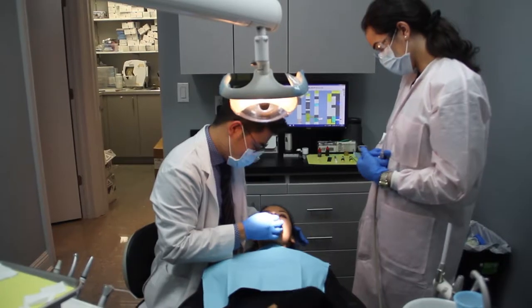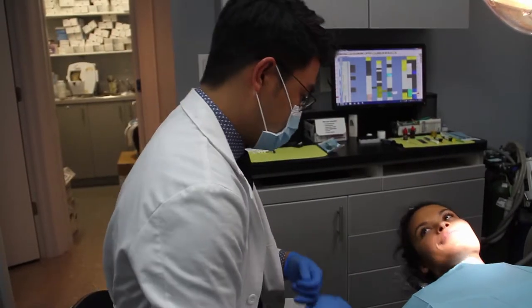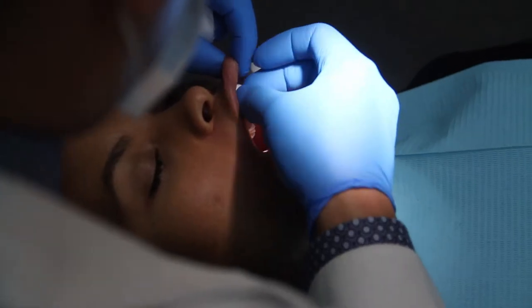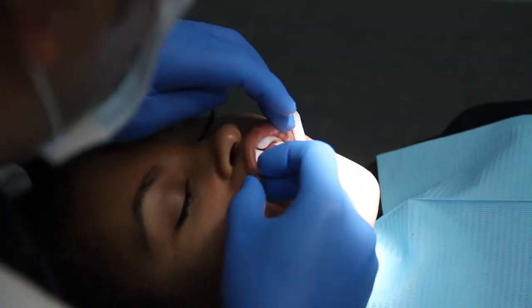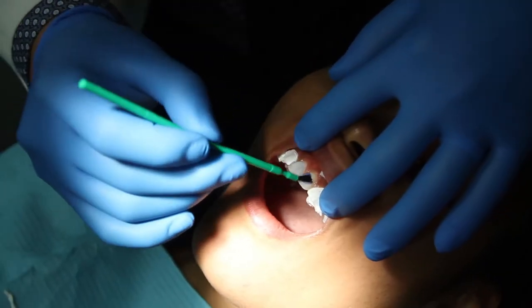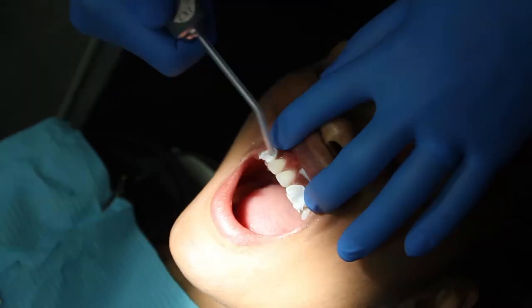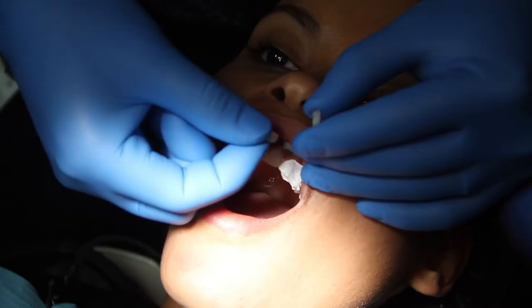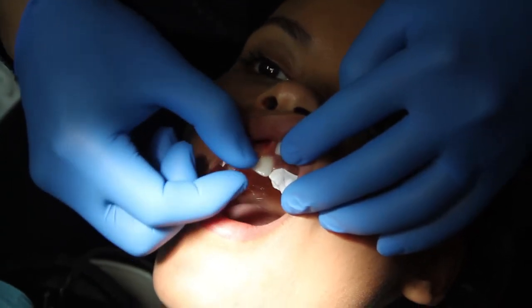Doing two veneers is actually sometimes very difficult because we have to blend in, and a lot of people don't want to shave down their teeth anymore. What we do best is to come up with a very natural look with the thinnest veneer. But when we are doing two teeth we want to give it a little character. Character is really important to give the natural look.